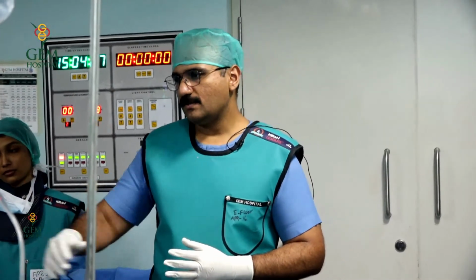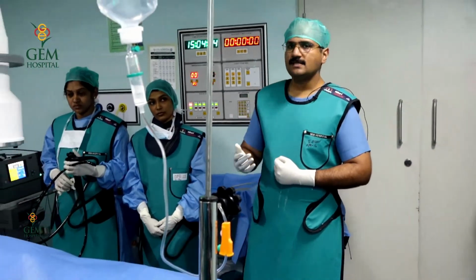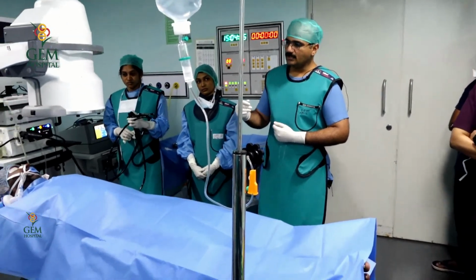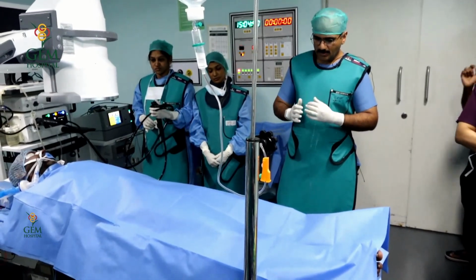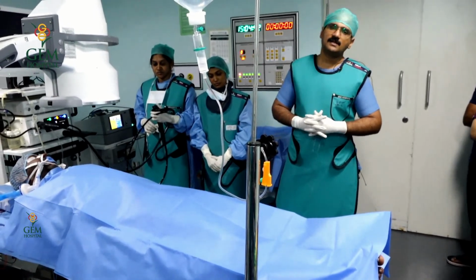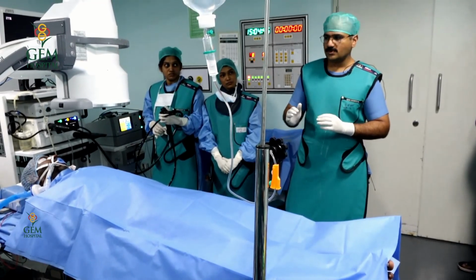You can see the patient in the supine position here. And the team has already been introduced. We'll get over to the case. We have selected a basic case like this to make sure that the basics are covered, and this is to facilitate the right steps to be done throughout the procedure.